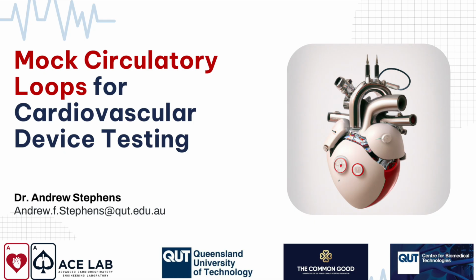On the bottom left-hand corner here, we have a system where it's literally just a piston pushing the water in and out. So that's like a pusher plate. And the final one we have in the middle at the bottom is a physiological system where they've actually built different channels inside the heart, and then they inject air in it, and that causes it to beat in a very sort of physiological torsional way, or at least that's the idea.